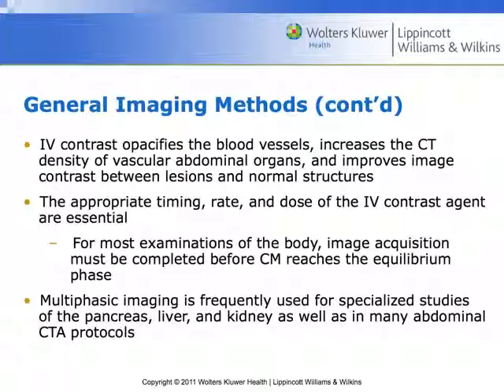And then other structures that might require multiphasic imaging might include the pancreas. Multiphase imaging of the pancreas will also typically give the patient water to drink prior to scanning. Even though we may ask for barium within the small bowel or the large bowel, we may give them a little bit of water right before we scan, like 30 minutes prior to scanning, and that will help better appreciate if there's any stones.